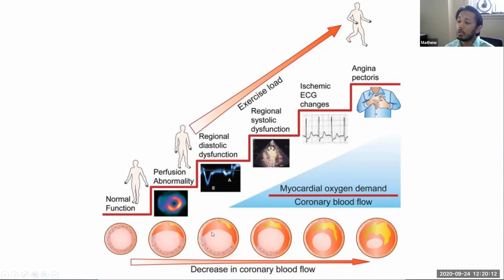As we get to the decrease in coronary perfusion to the right, then we also see that now we're going to start seeing imaging show up on the echo. So again, the echo is now going to become more sensitive.